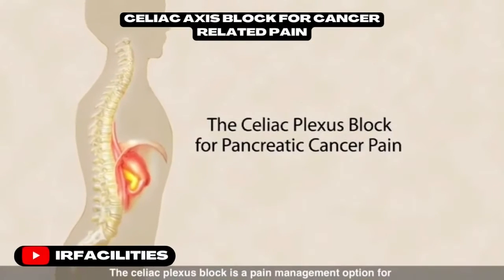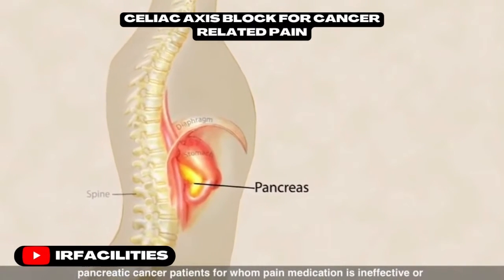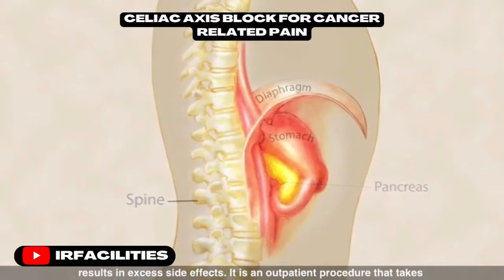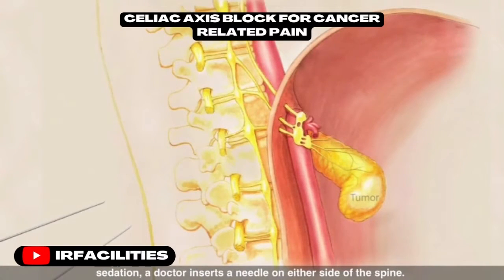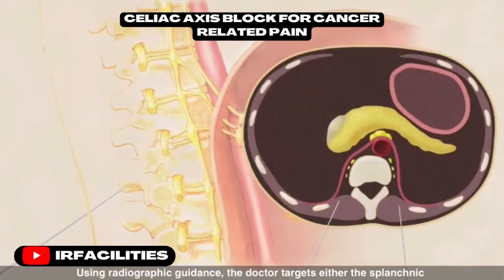The celiac plexus block is a pain management option for pancreatic cancer patients for whom pain medication is ineffective or results in excess side effects. It is an outpatient procedure that takes about 45 minutes, with the patient lying face down under light sedation. A doctor inserts a needle on either side of the spine using radiographic guidance.